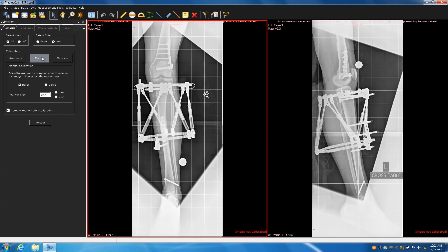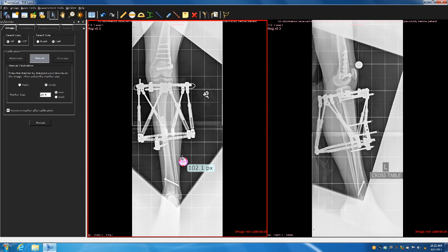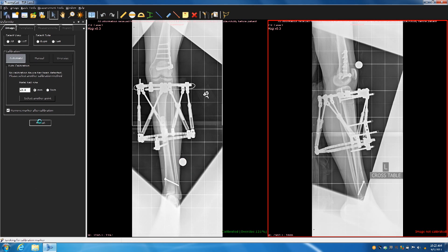Hit manual — that's really important, so be careful. If you hit circle and then click on the image, it gives you the circle tool. Kind of adjust it to fit, drag it down to the little ball. That's a 2.5 centimeter, 25 millimeter sphere. Hit accept. Do the same — you can see how it automatically found the mag ball. It usually does that. Put lateral, left, and hit accept.